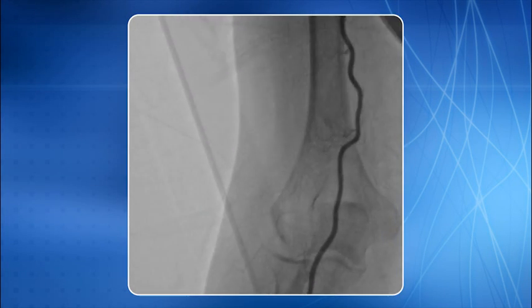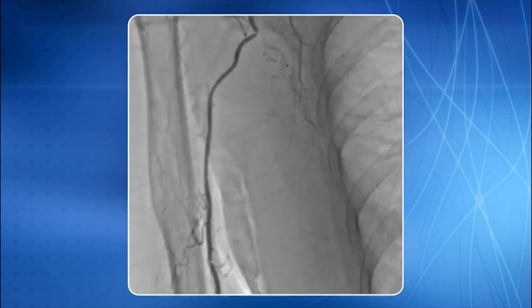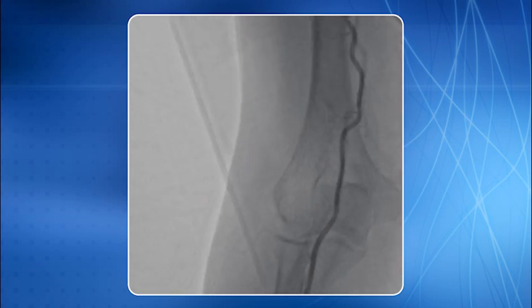Understanding of this particular anatomy is important for a radialist, as radial artery is almost invariably of small caliber and it gives a feeling of spasm while negotiating the catheter over the wire. Sometimes you need to downsize the catheter, that is, instead of 6F a 5F guide catheter and instead of 5F a 4F diagnostic catheter should be chosen for smooth and successful completion of an intervention or an angiogram.